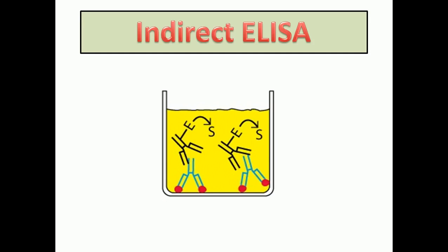Now in the laboratory we can create different types of antigens, we can add different varieties of antigen in different wells to produce different specific reaction kits, right? Now this process is called indirect ELISA, because in this case the first antibody, the primary antibody that we use, is not enzyme linked. The secondary antibody is enzyme linked, and that is the anti-primary antibody to react with. So this process of enzyme linked assay is not direct. That means the first antibody that we use is not attached to the enzyme.